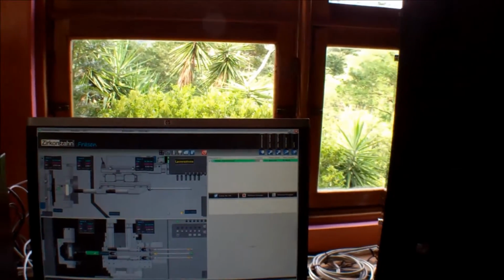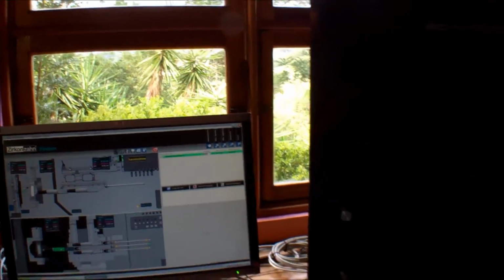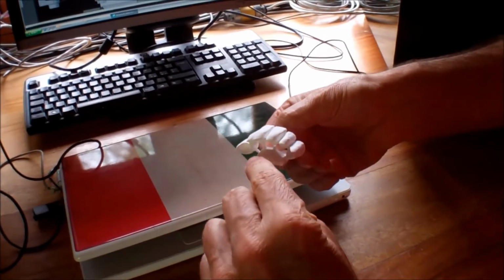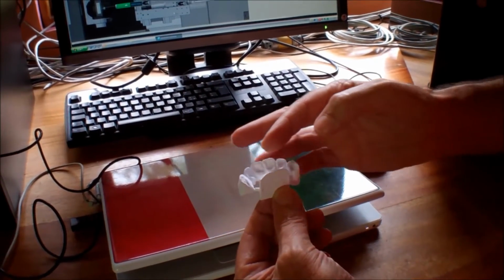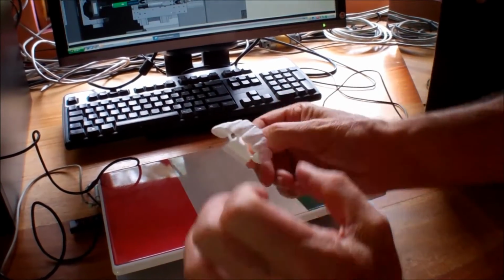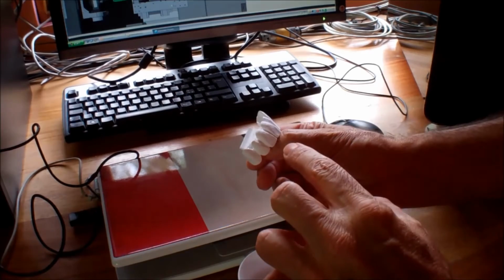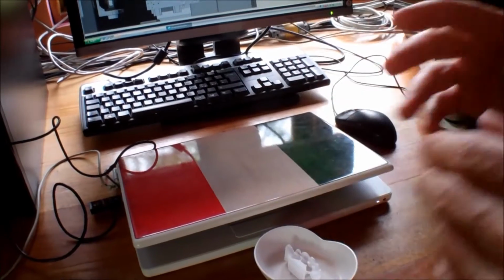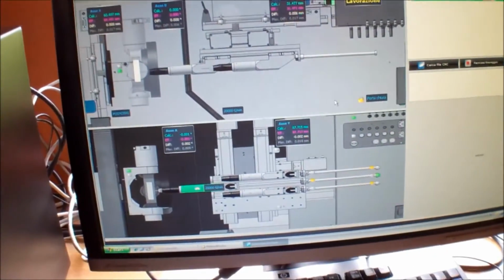Can I see what a blank looks like? That's going to be what comes out. This is not you. This is another patient. This is the zirconia. All the anatomy is where the function is, and then we are going to build up with the porcelain, the vestibular. You see a big size because the machines mill the work 21% bigger than the real size. Then you have to put this in an oven down there and sinter the material.